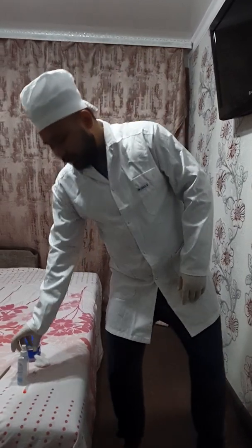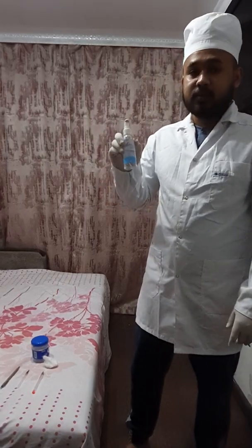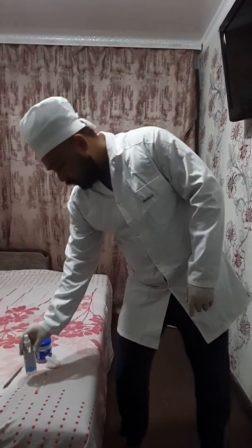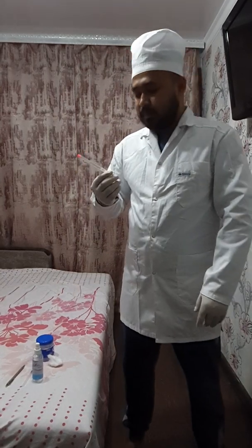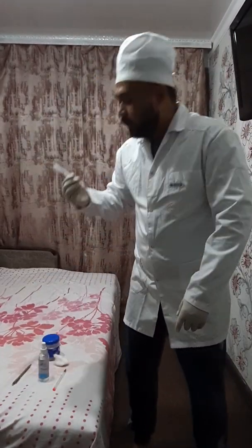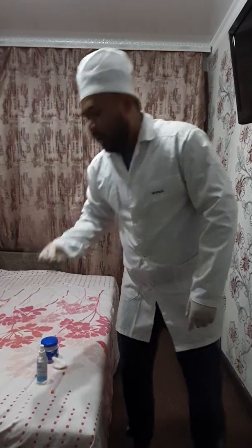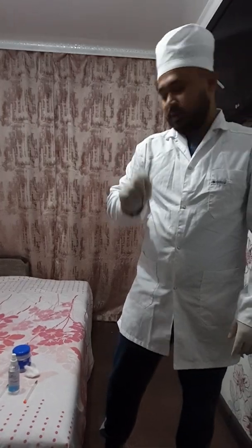So basically we need a CSF collecting tube in which we will keep that CSF for investigation, and we need an injection basically to apply anesthesia to the lumbar area, and we need a manometer to detect the opening pressure of CSF, and the CSF obtaining needle which will penetrate through the lumbar region into the patient's spine, and will obtain the CSF.